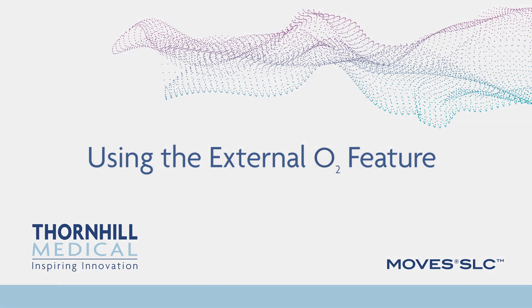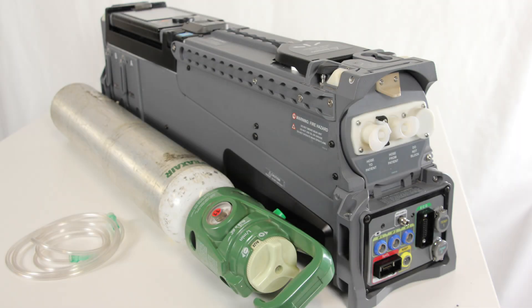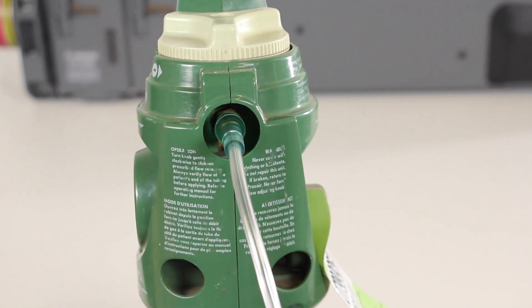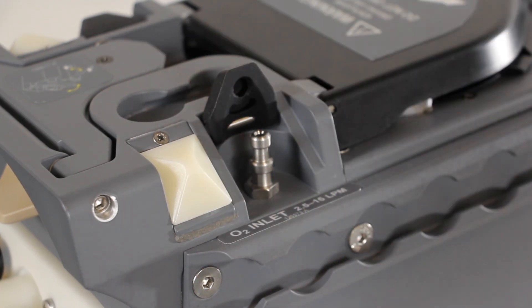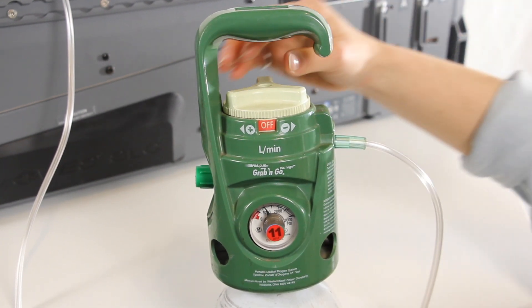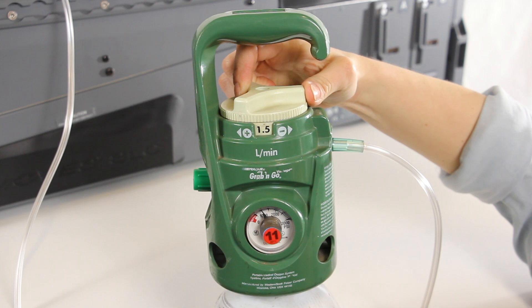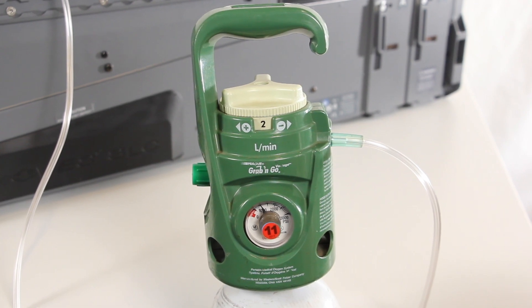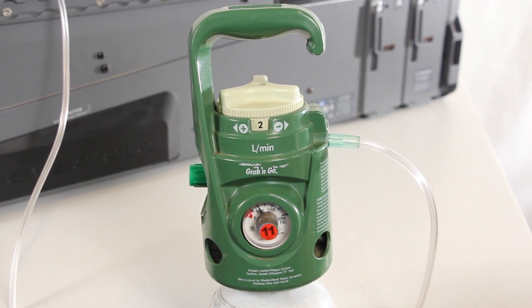Using the External O2 feature. To use the External O2 feature, prepare a compressed O2 tank fitted with the flow controller. Prepare a line of tubing that can be run from the O2 tank to the O2 inlet port on the right side of the MOVES SLC unit. Connect one end of the External Gas Supply tubing to the O2 tank. Open the protective cover of the O2 inlet port by lifting it. Attach the other end of the External Gas Supply tube to the O2 inlet nipple. Open the flow control valve and adjust to the desired flow rate, which must be less than 15 liters per minute. When using the O2 inlet, gas flows of 1 to 2 liters per minute can be used to conserve external oxygen tanks.